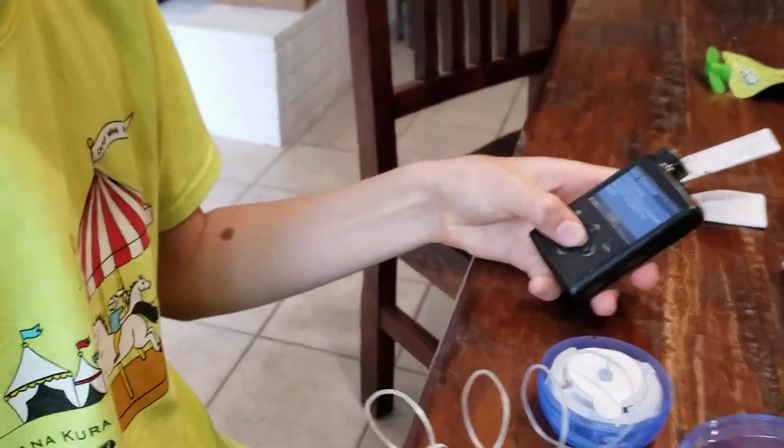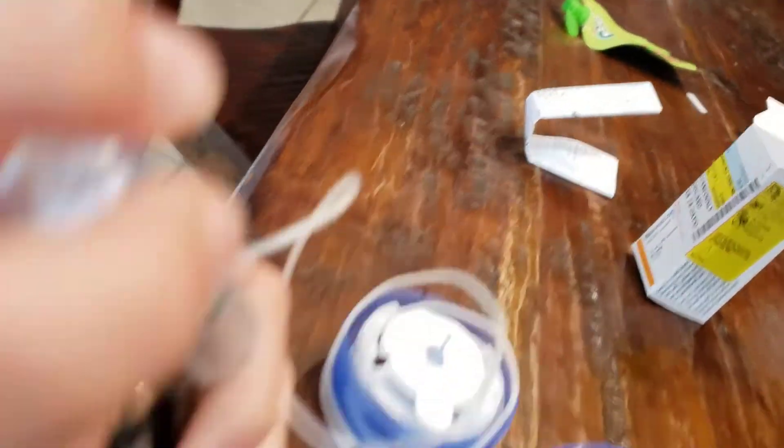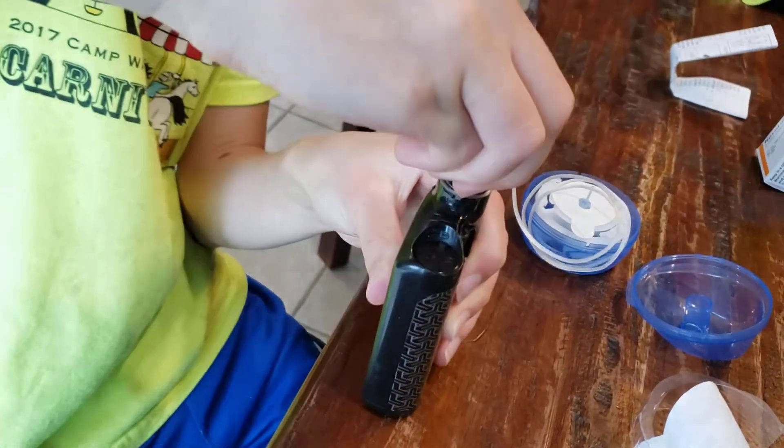What does it say? Place reservoir into pump and lock. So you put this in and then you turn it a little bit, and then it will lock.